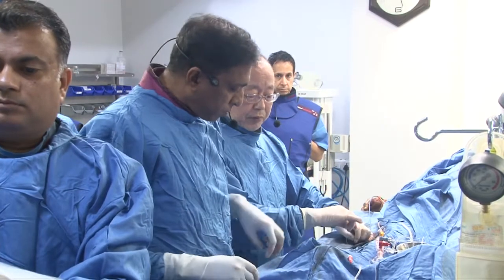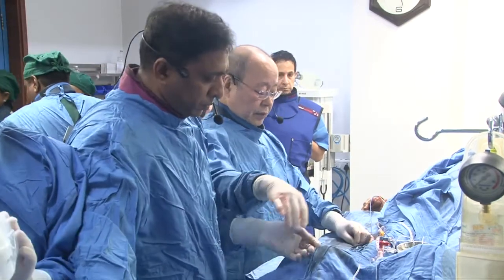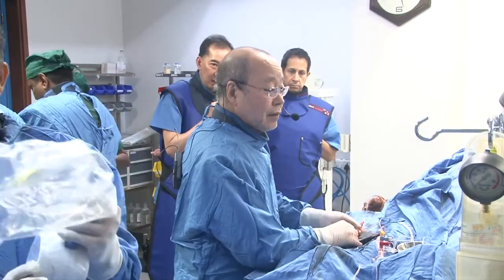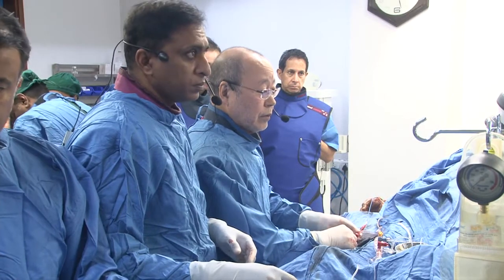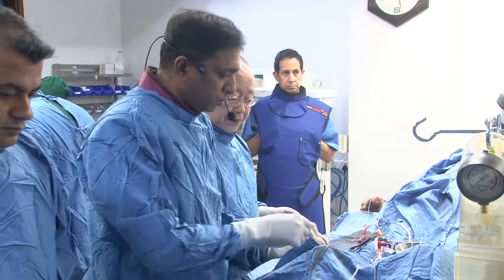I want to remove this one. So Dr. Saito, the panel asked what you are looking for from the intravascular imaging. You're looking for calcium, the length of the lesion, what else? I think there should be some calcium, not so much, but some calcium.